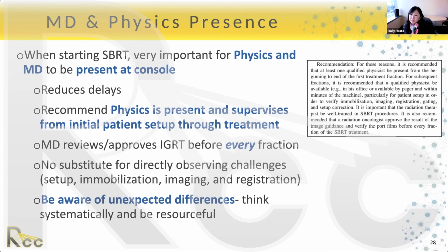If you have other physicists around who can partner with you, call the physicist. So just be aware this happens and it's okay. Be resourceful, take a pause, and be systematic about trying to troubleshoot what it is that you're encountering. It's not uncommon, especially when starting out, that these things happen. And so it's okay that these unexpected differences pop up.